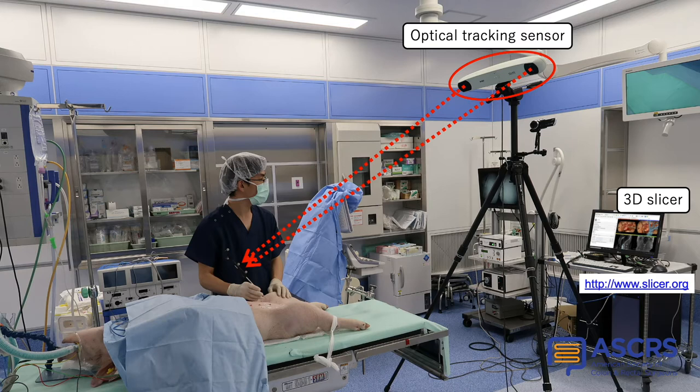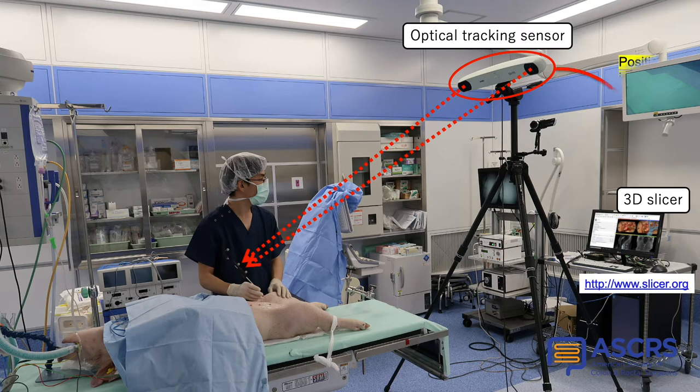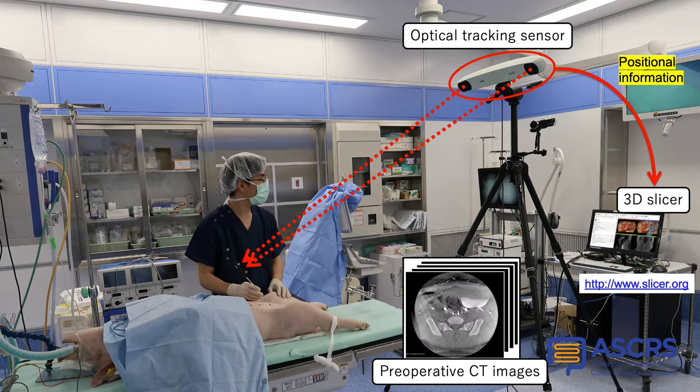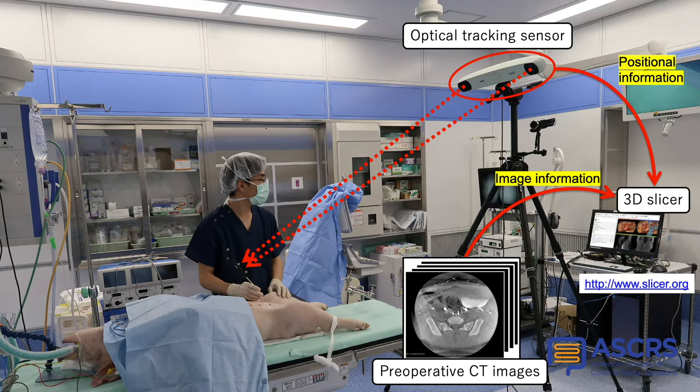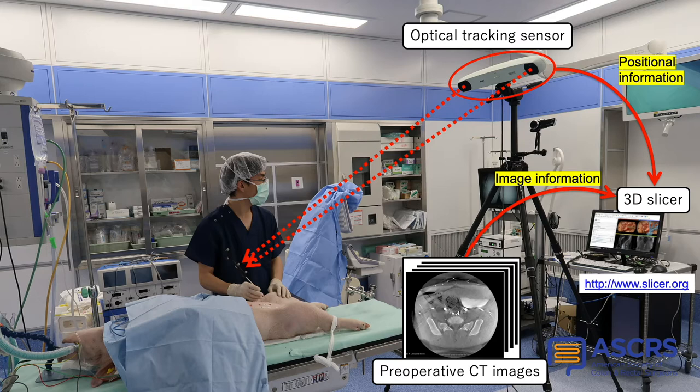The navigation system is based on these data; it integrates positional information from the surgical field with preoperative images, such as computed tomographic images. In the system, the position of the forceps can be displayed on CT images based on the positional information from the tracked forceps.